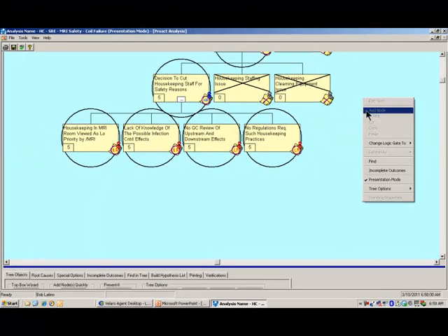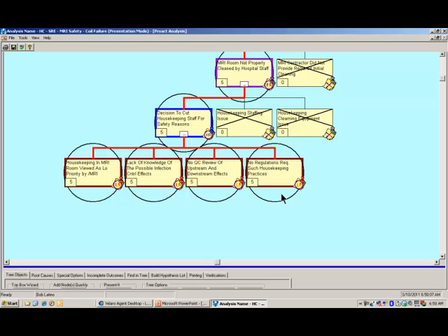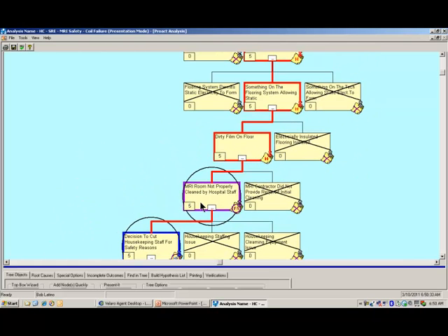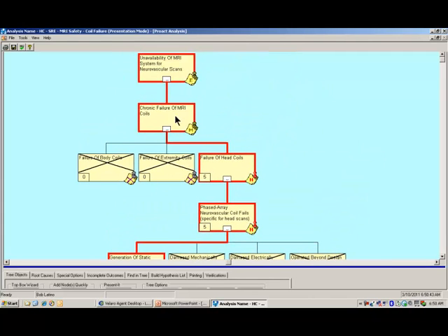So when we look at this in its total, and we activate a show path to failure feature here, the LRs are the latent roots. These are the systemic issues that fed inadequate information into the decision maker's head, which is the HR. So we have failed or flawed systems which feed poor information to decision makers. As a result of that, they make poor decisions. And then we can correlate directly by cause and effect all the way from bad systems to bad decisions, all the way up until we experience the unavailability of the MRI system for neurovascular scans.